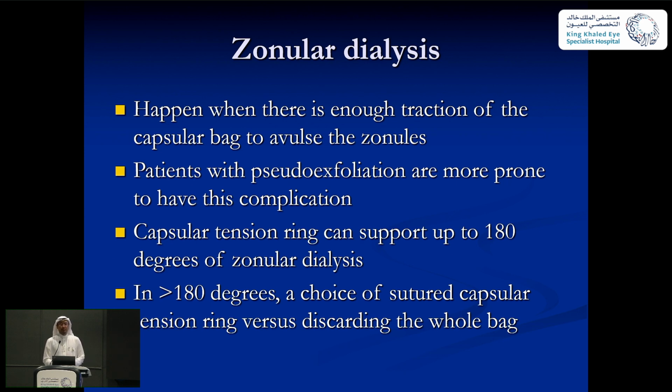If we have, especially with large nuclei or very hard nuclei, we tend to do vigorous maneuvers, and we forget that there is a bag that is suspended by the zonules. So just keep this in mind. You don't want to disrupt the bag as much as possible. You are trying to do your phaco without disrupting the bag. Minimal displacement during cracking, minimal displacement.